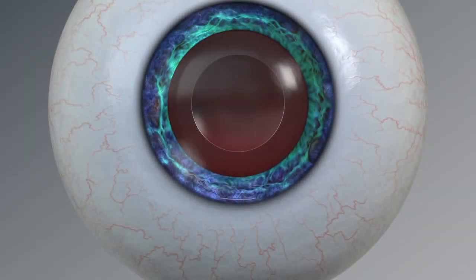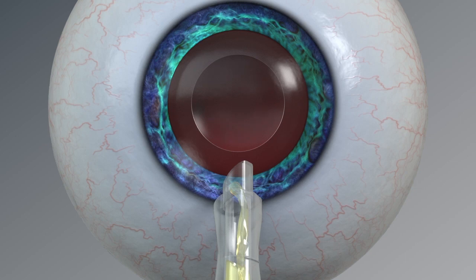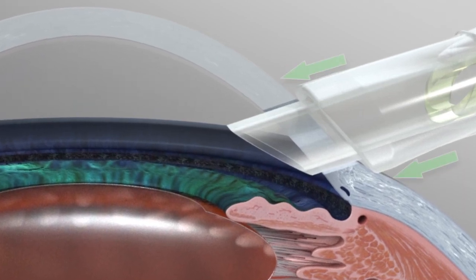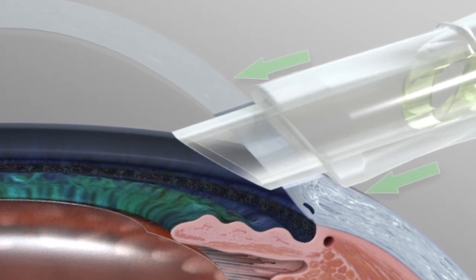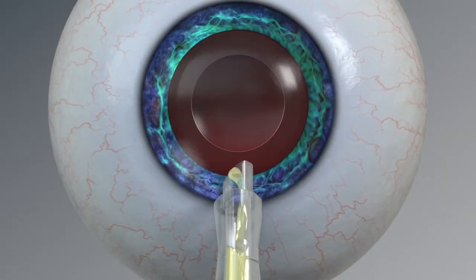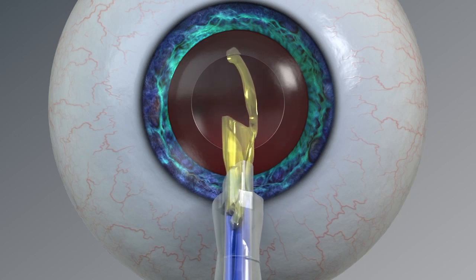First, place the nozzle tip into the incision up to the depth guard. Then, rotate the device clockwise to place the device in a bevel-left or nozzle-opening-facing-left orientation. When rotating, maintain adequate pressure of the depth guard against the cornea to ensure the nozzle tip remains inside the incision. Additionally, a second instrument can be used to maintain eye position. Advance the plunger and focus on the leading haptic. Ensure it points to the left or slightly downward into the left, and that it enters the capsular bag in its correct orientation.